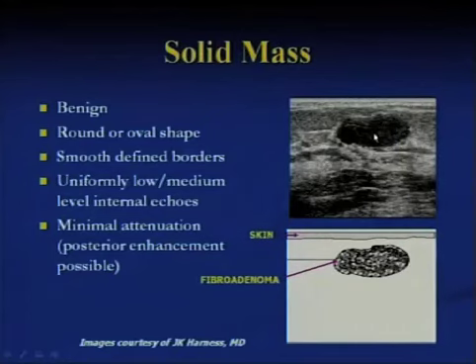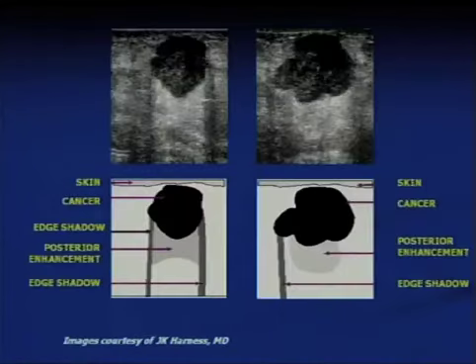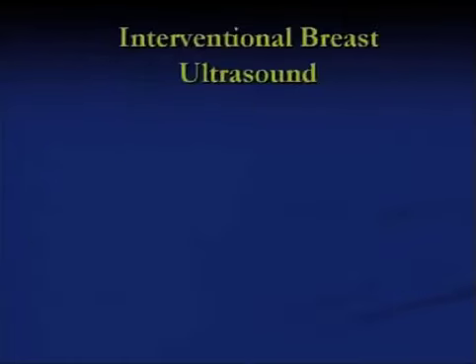While we cannot absolutely say that this is a benign lesion, a core biopsy showed this was a very typical fibroadenoma. On the other hand, comparing two different views of a cancer that's taller than it is wide — the internal echoes are heterogeneous. We're not trying to make a definitive diagnosis; the definitive diagnosis in a case like this is made either with an ultrasound-guided FNA or core biopsy.